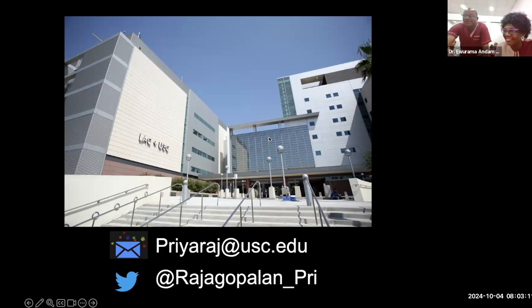Thank you very much, Dr. Priya. Your presentation was quite enlightening, and you had a lot of interesting images on it. There was one that made mention that we should be careful, especially there was one in the spine that looked like an aneurysmal bone cyst, an ABC, but you said it was a form of a metastasis. Now, my question is, for the purpose of the kind of spotters we use when studying and whatnot, is there a way to differentiate just based on the image, assuming we didn't have histopathology to go with it? Thank you.